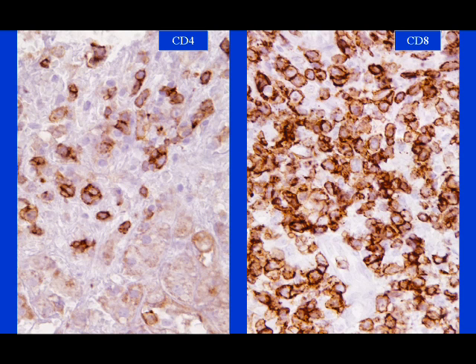Here is a lymph node biopsy from a young child who had a perforin gene mutation, a homozygous mutation, which led to the absence of perforin in the granules of the cytotoxic T lymphocytes and the NK cells, which stimulated increasing production, increasing numbers of cytotoxic T cells, and elaboration of cytokines by the T cells, stimulating histiocytes, which elaborated further cytokines, leading to this marked hemophagocytosis and destruction of the multiple organs that occurs in these patients. The sections of the lymph nodes here show a CD4 stain.